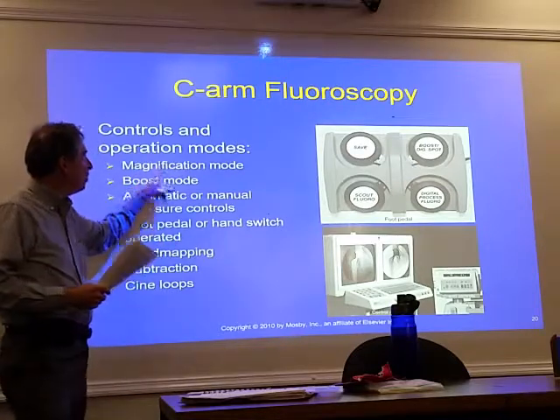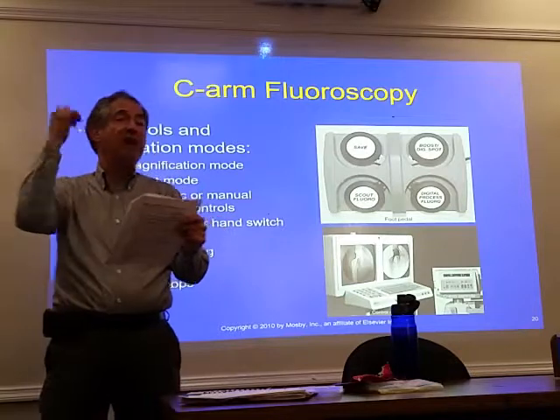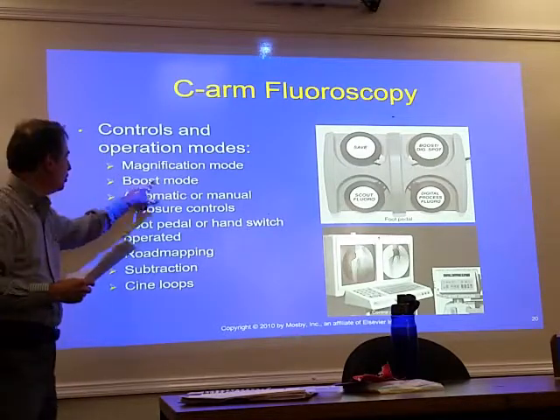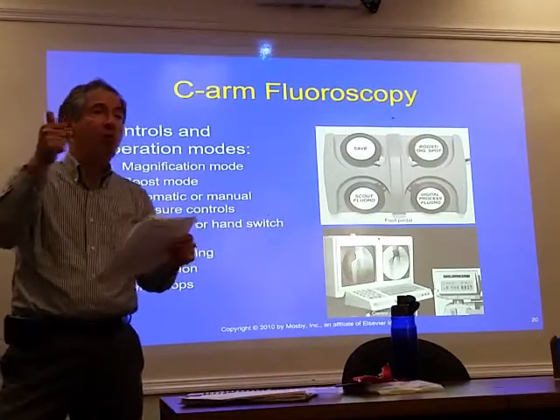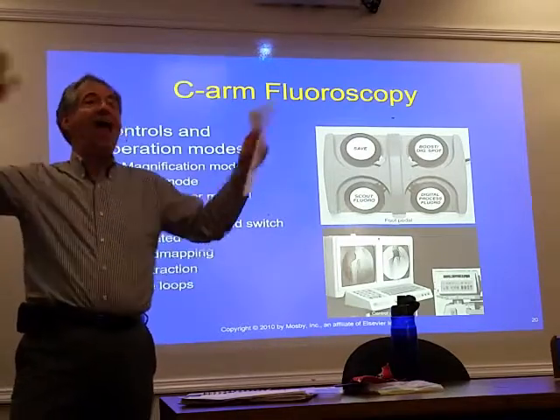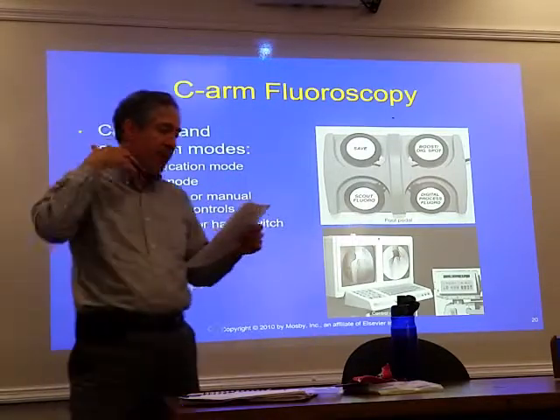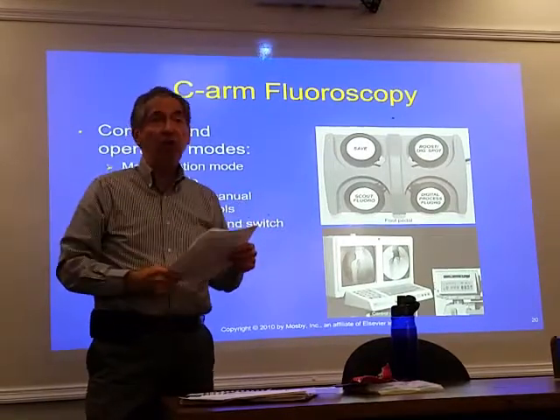So magnification mode, they're going to tell you to do that, okay? Just keep in mind, it will magnify the image, but it's also going to increase the dose for everyone in the room, all right? Boost mode, be real careful with that, okay? You use boost mode when you're doing something like a cross-table lateral lumbar and the patient's big. If you can get by without using boost mode, that's going to be much better, because it could increase the dosage for everyone by a factor of 3 to 4.